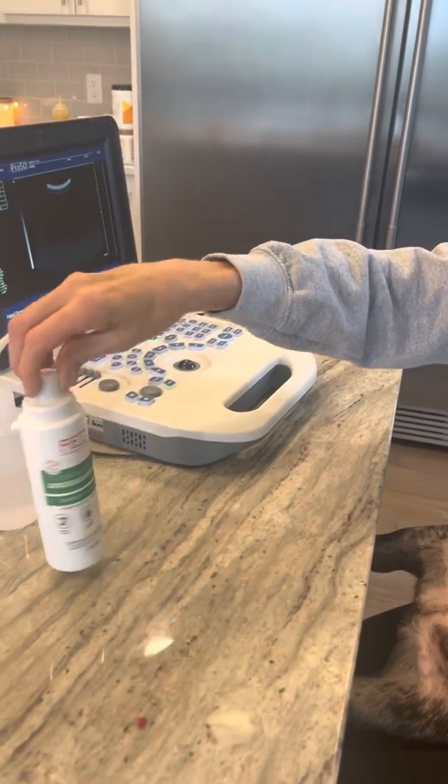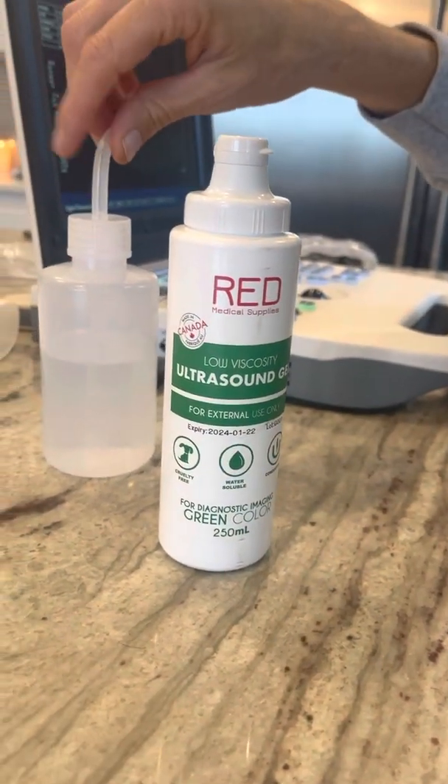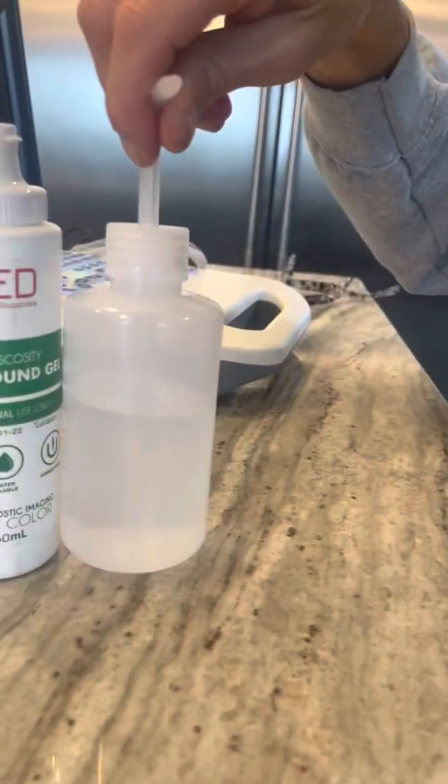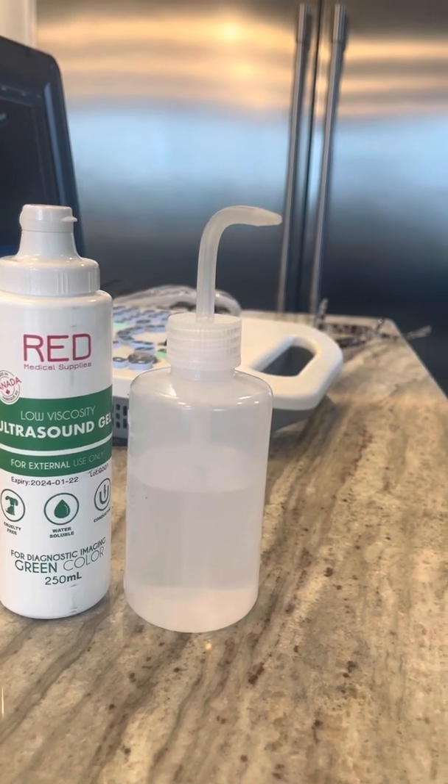I'm going to show you two things that you can use for the ultrasound. Number one is the ultrasound gel. But what I find is to get an even crisper view — and this is kind of what they do at a lot of vet's offices — using simple alcohol.